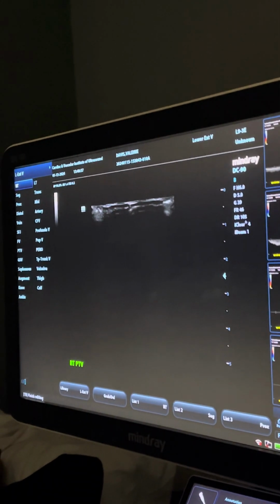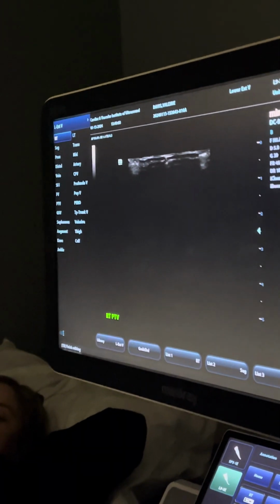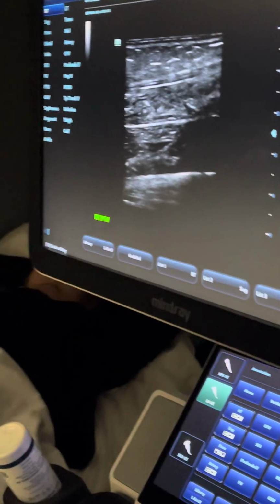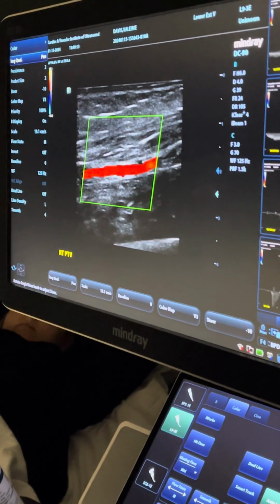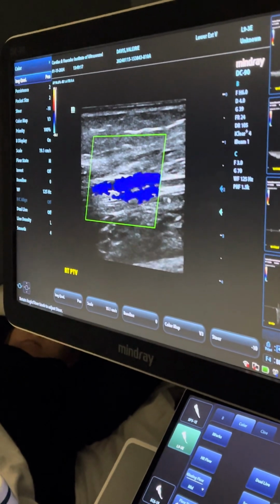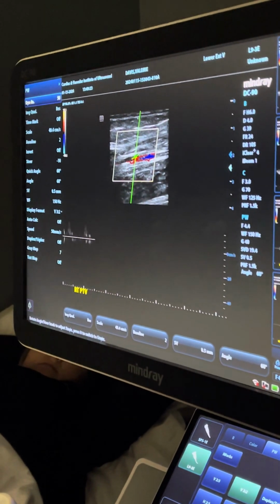So we've had common femoral, deep, proximal to distal femoral, popliteal. Then we're coming to distal PTV. First thing we're gonna do is decrease our depth. Our artery is gonna be our landmark. So whenever I find it, I'm gonna come up a little bit, and I'm gonna have to squeeze distal to get this to come in. You have 2 of them.